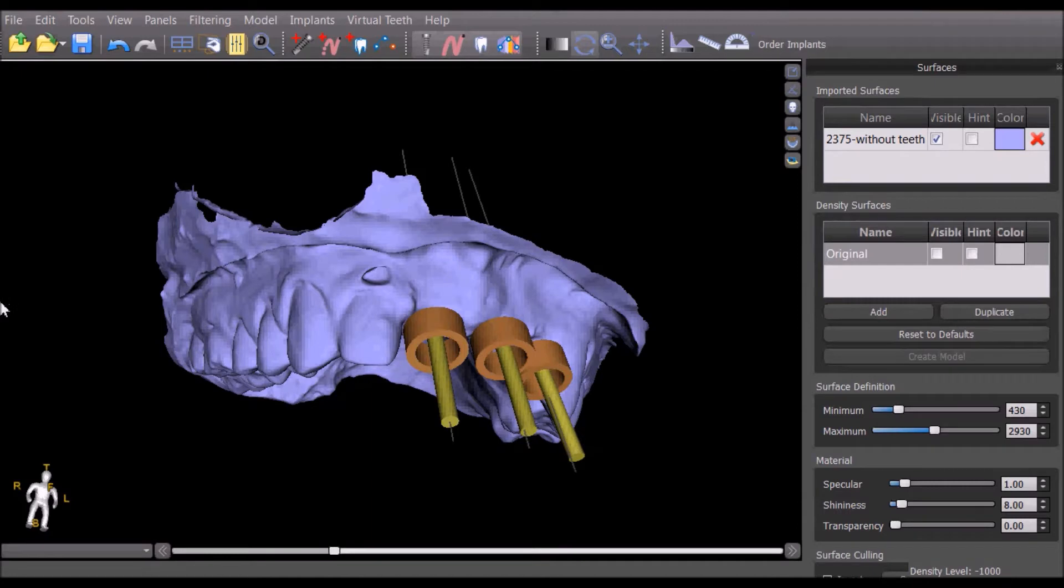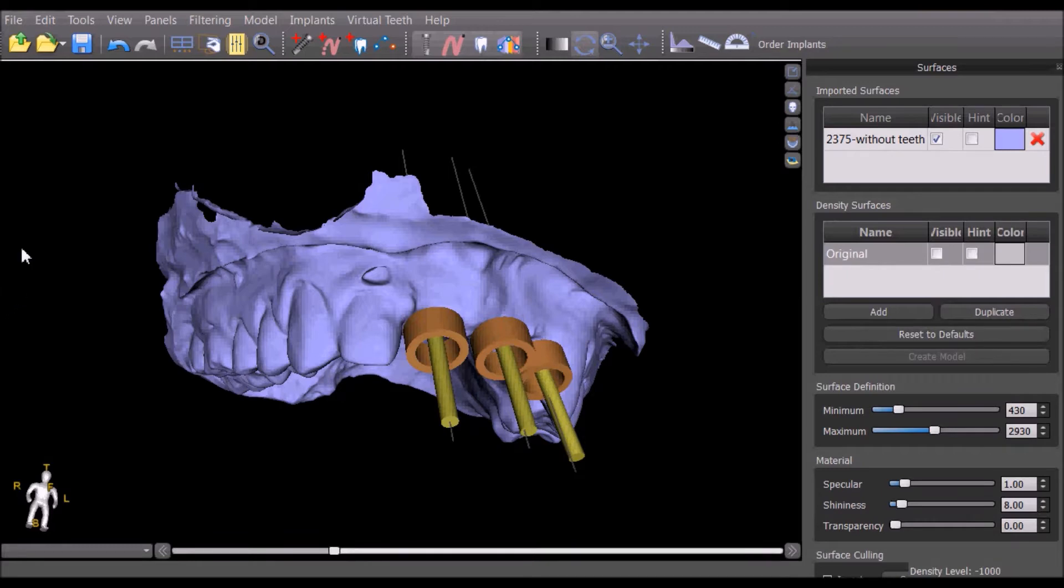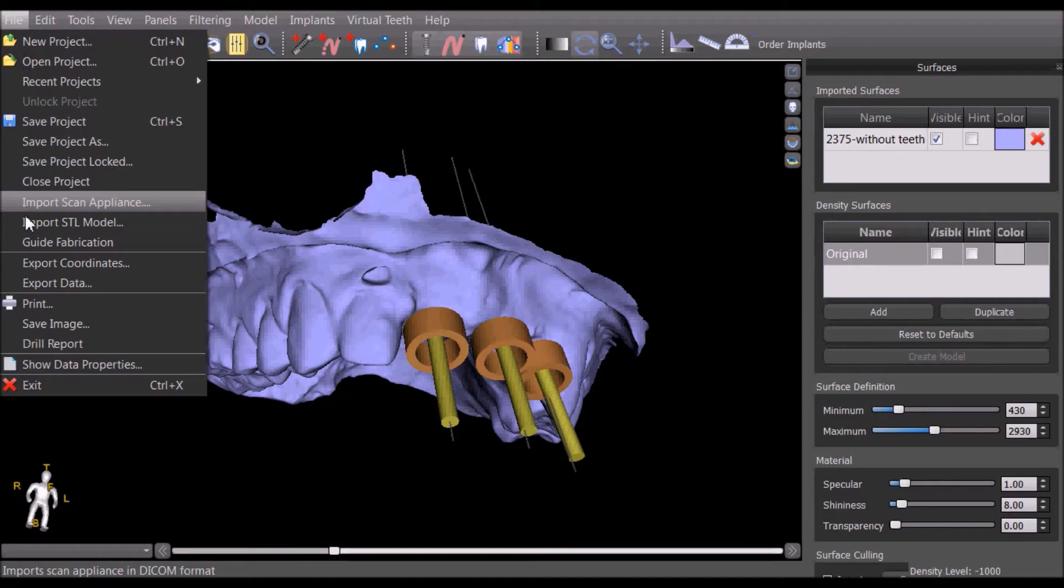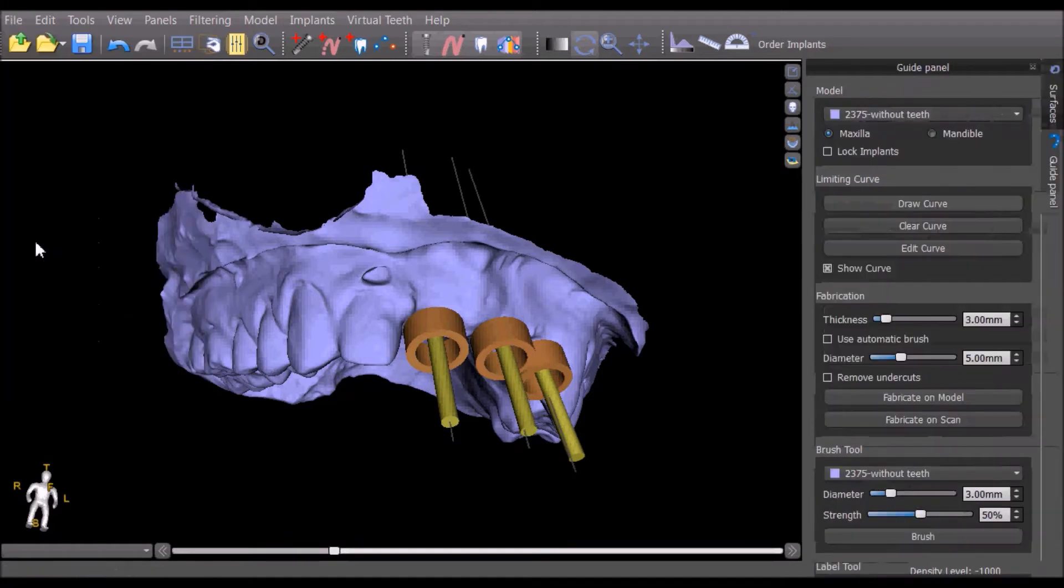We are starting from the point of a completed treatment plan and the tubes with the correct settings. The guide fabrication functionality can be opened by going to File, Guide Fabrication.